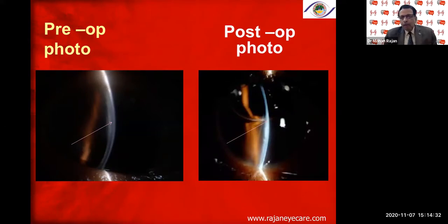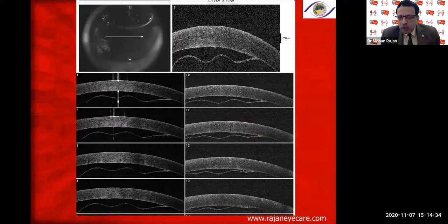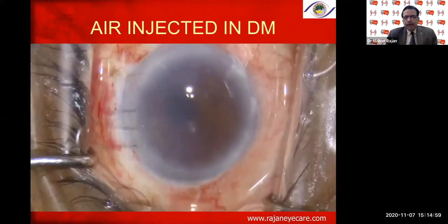But more importantly, if you have access to anterior segment OCT, it will tell you whether it's a simple corneal edema secondary to TASS, or because of excess phaco energy, having used phaco energy for a hard brown cataract, and that can also cause a corneal edema. But normally that doesn't cause a limbus to limbus corneal edema. As you can see here, there's a total Descemet's detachment in this particular case on the anterior segment OCT, and I went ahead and did an air injection.